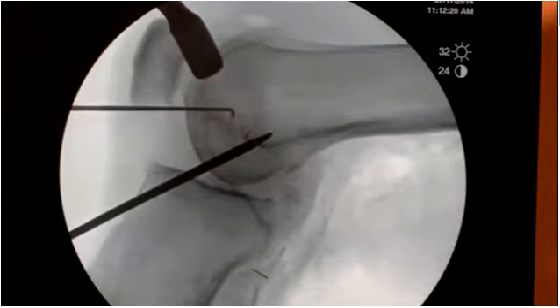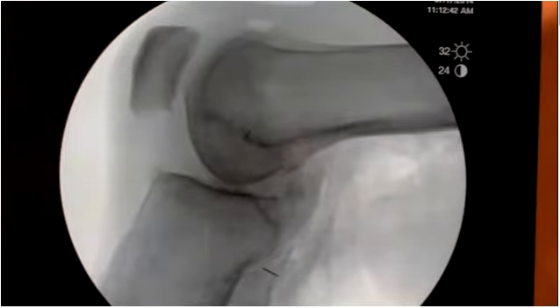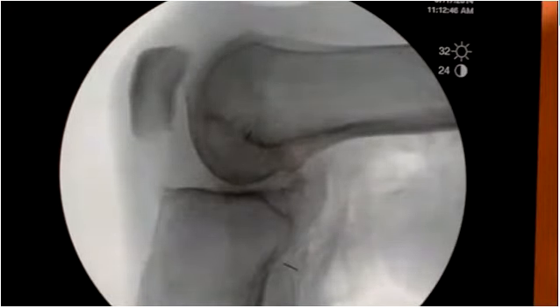Okay. All right. And then the distal part, if we come here, fluoro. Sorry, it's a little bit, if I flex the knee. Fluoro. Yeah, we can't see it. Can you move the video down on the tibia? I'll just move.